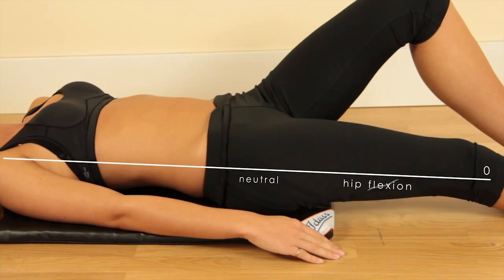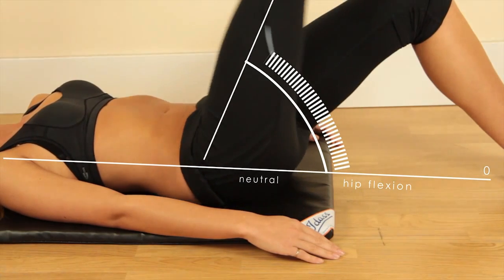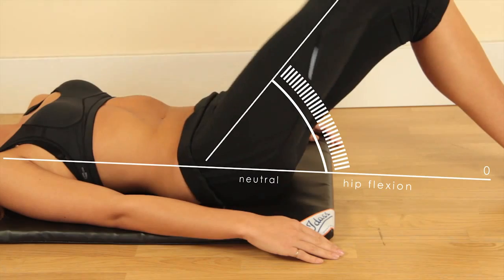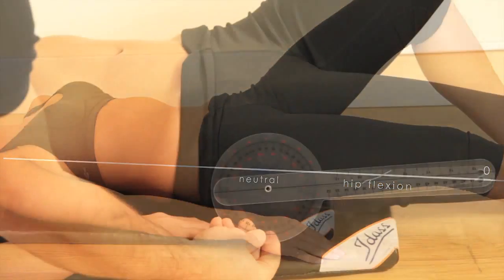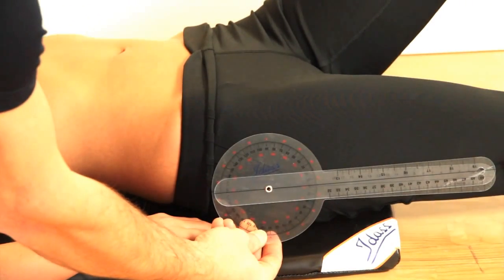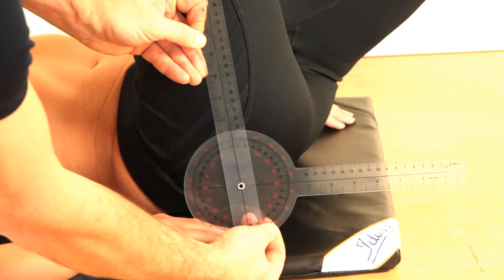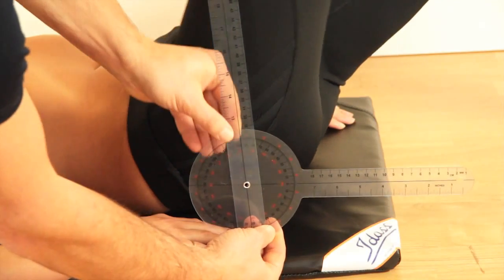Flexion and hyperextension of the hip joint. Flexion is measured from the horizontal neutral position vertically up, without lifting the hips from the floor. Use the hip joint as a reference point to measure hip flexion, which should be about 110 degrees.